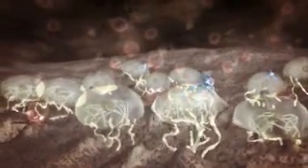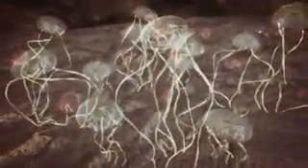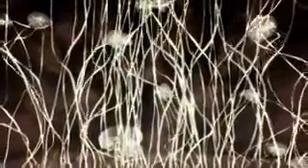In the first of the major steps of bone formation, extracellular matrix is produced beneath the osteoblast, causing it to lift off the surface and rise upwards. As more and more extracellular matrix is produced, osteoblasts become trapped within the growing matrix, forming osteoid. This then mineralizes into woven bone, the second stage of bone repair.